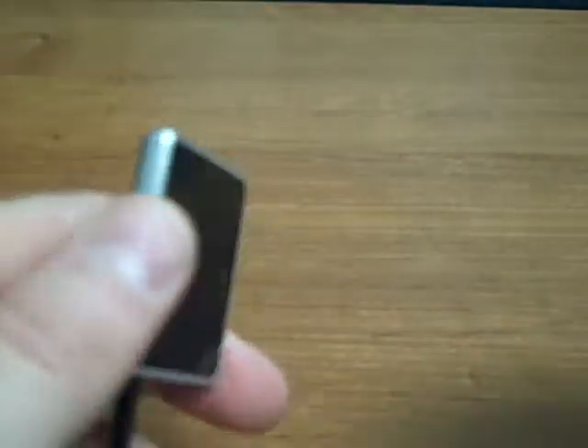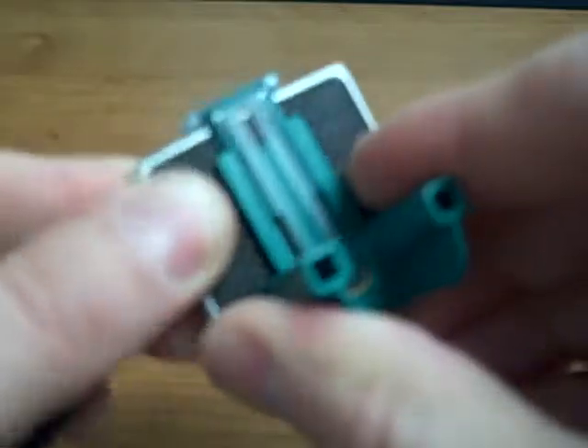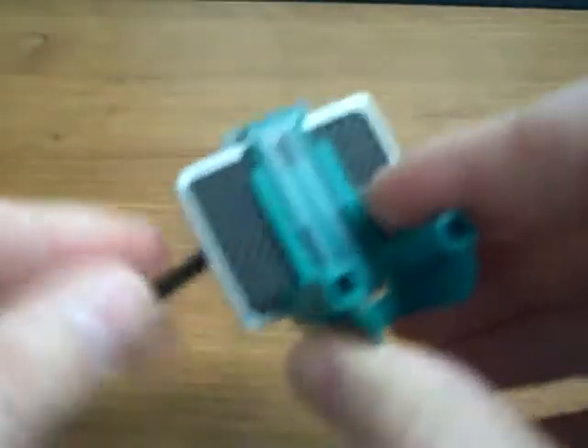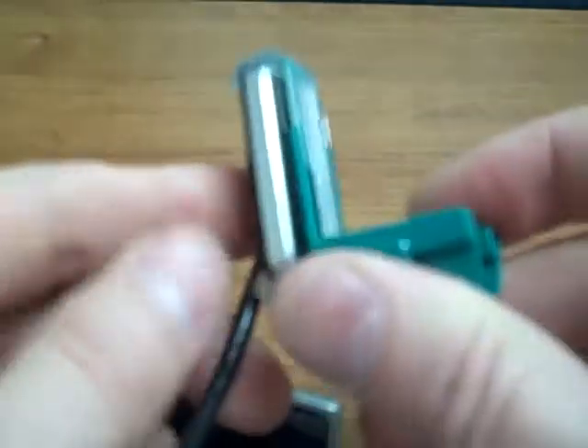There is an endodontic bite block in the XCPDES Fit series. With size 2 sensors, it will accommodate them in the horizontal orientation, and with size 1 sensors, you can load it in the endo bite block in the vertical orientation. So a really nice universal system — XCPDES Fit shown here with the VistaRay by Durer.